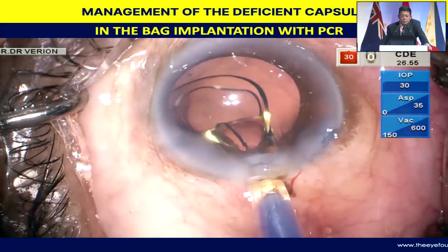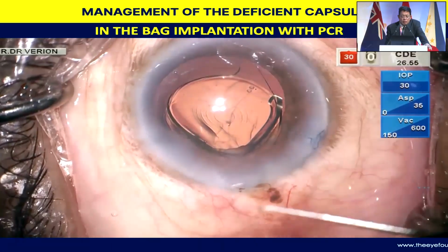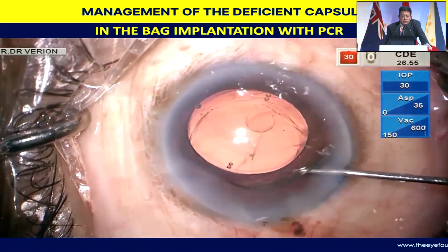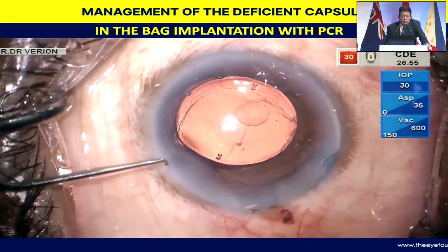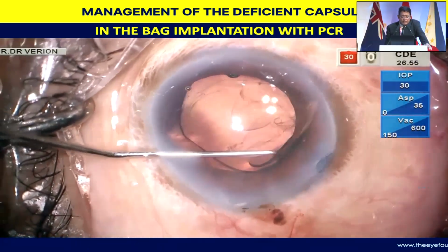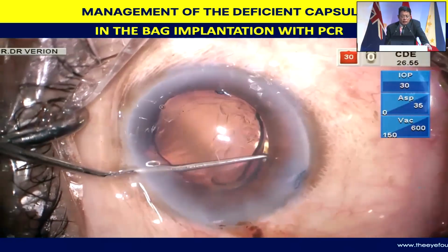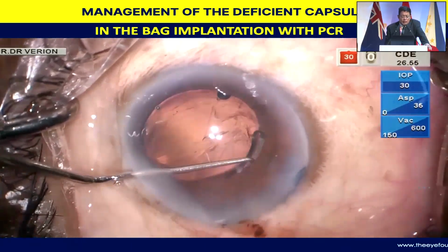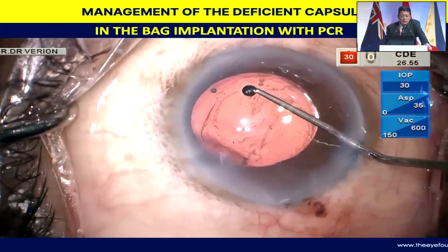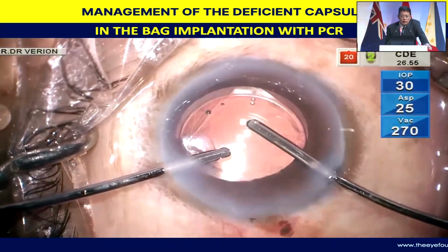Having inflated the back quite adequately, this patient was to receive a trifocal toric intraocular lens. The lens of my choice is being injected. The Verion display is on all the time, though it's not being shown up on the video. You'll see it towards the end. So without disrupting whatever support of the capsule that is there, and with this lens going into the back, premium intraocular lens, I'm able to maneuver the haptics inside also, and then position the lens exactly according to where it needs to be, evacuate the viscoelastic quite adequately.